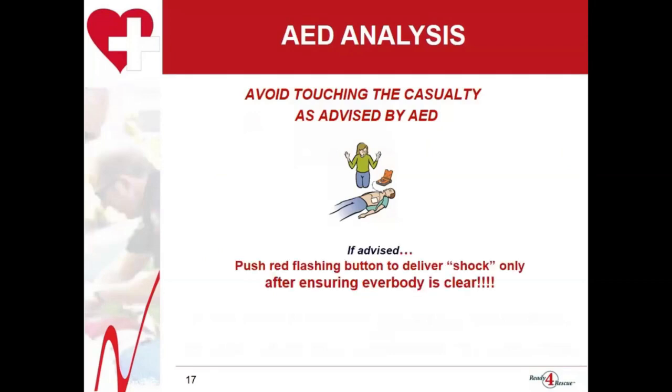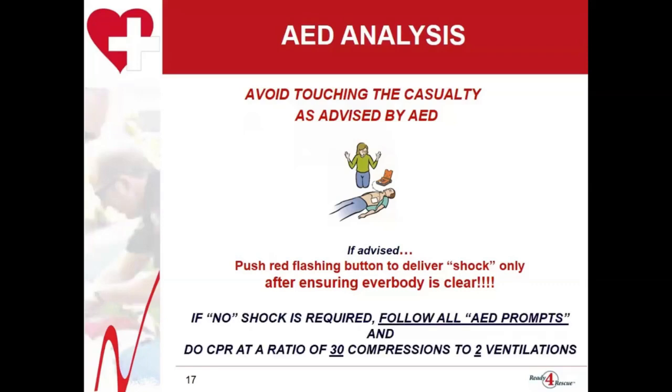If the AED advises you to push the shock button, say the word clear, nice and loud to ensure no one is touching the casualty. If no shock is required, it will prompt you to start CPR.